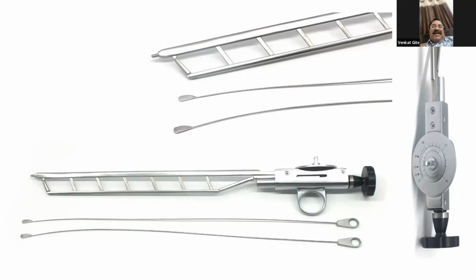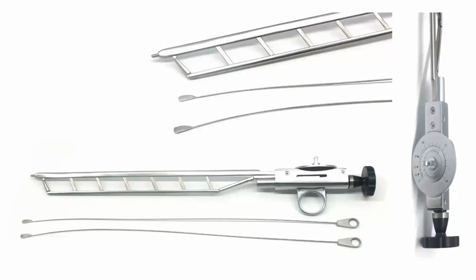It will go inside like a dilator because it is not open. Yes, and it is rounded at the tip, so it is not traumatic. But it is used for what? Distal part of the urethra or the proximal urethra? Distal mainly.